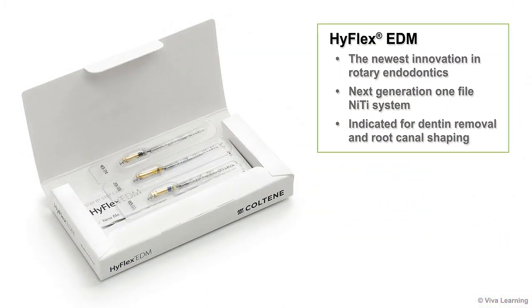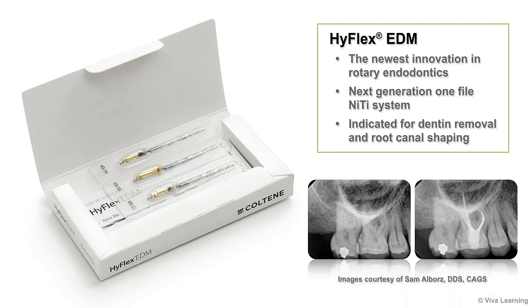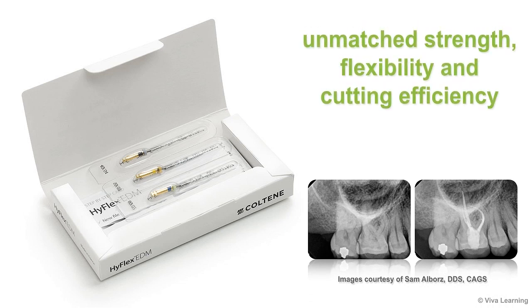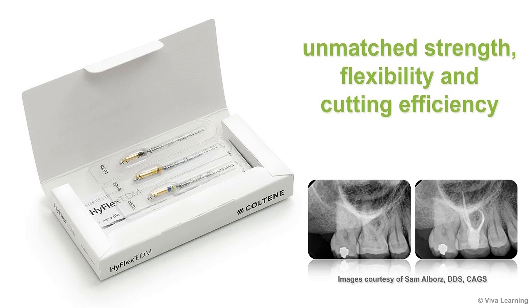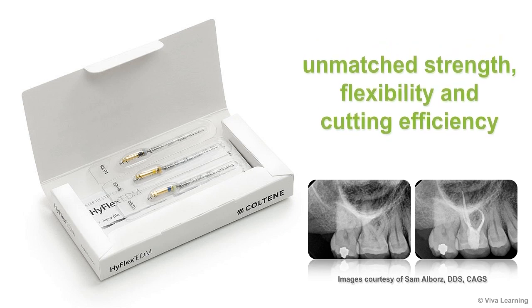Coltine is excited to bring you HiFlex EDM, the newest innovation in rotary endodontics. HiFlex EDM is the next generation one-file NiTi system indicated for dentin removal and root canal shaping. HiFlex EDM gives you unmatched strength, flexibility, and cutting efficiency for the preparation of even the most complex canals.